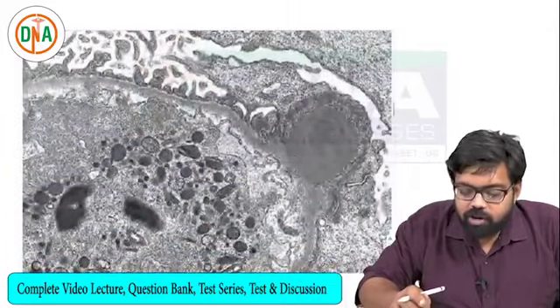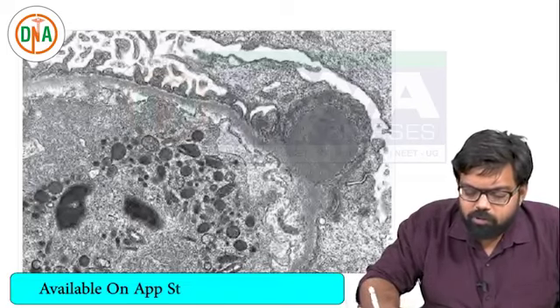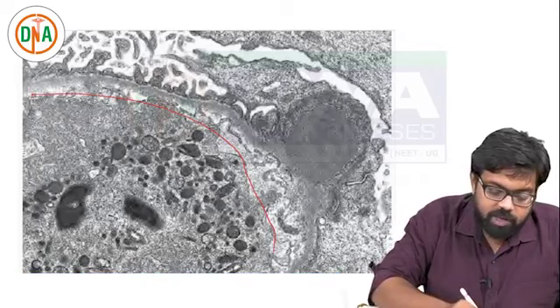Next, what we are looking at is the electron microscopy. So now, looking at the electron microscopy, see, this is the basement membrane.